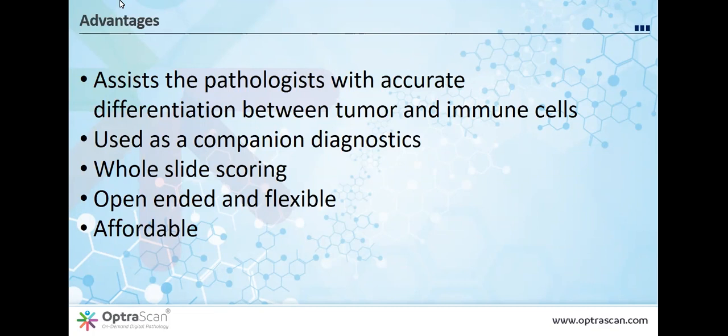With deep learning, algorithms can be trained even to identify some of those differences that I've just been talking about. So yes, it counts lymphocytes and it counts macrophages, predominantly those that have a representative cut through the largest diameter of the cell. And those that it can't identify with confidence, it ignores and doesn't score, which is what we do as pathologists anyway.